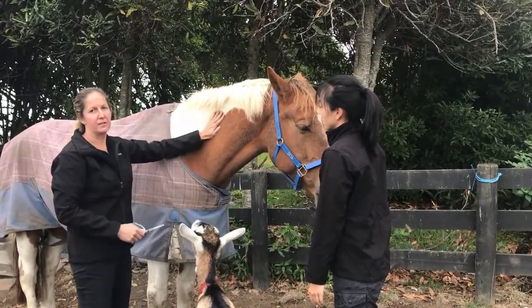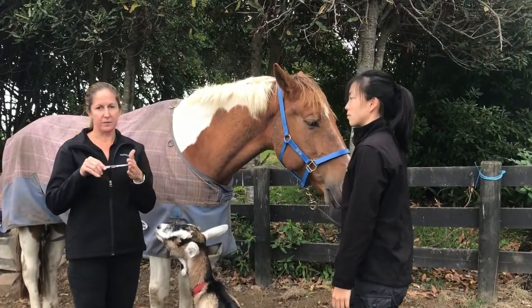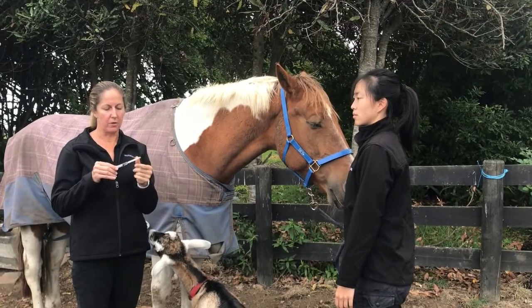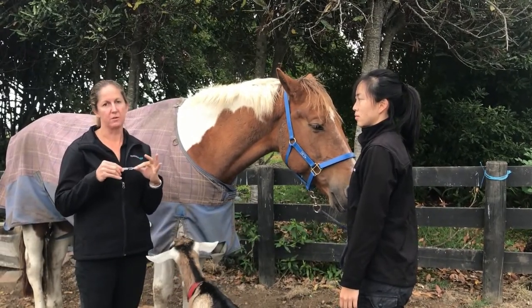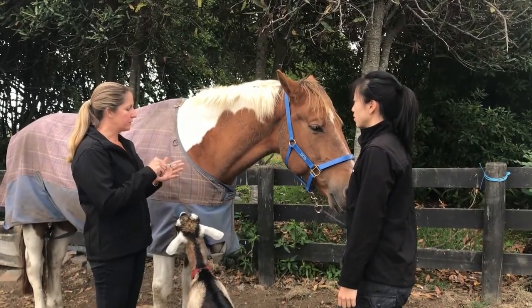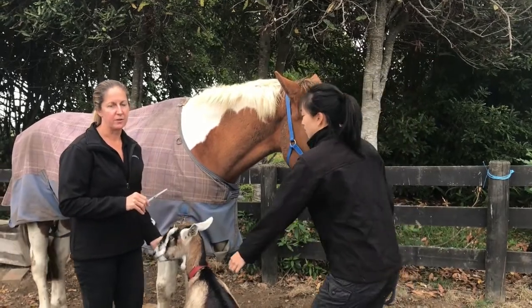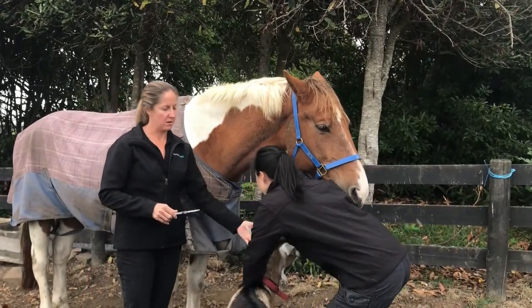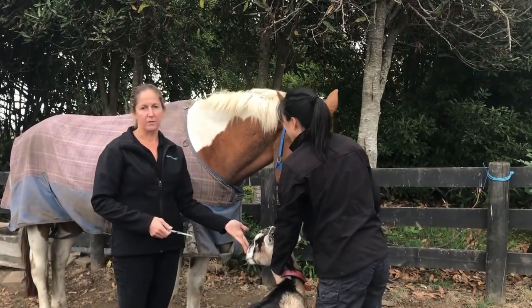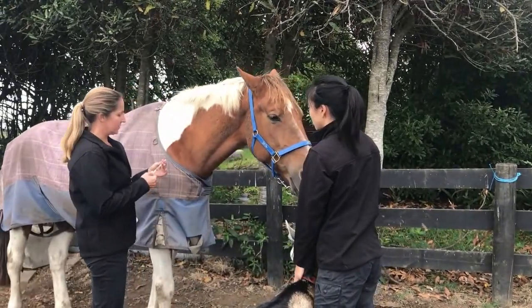That triangle is the safe zone. We recommend going straight in, perpendicular to the skin, all the way to the hub of the needle. That way, if they move toward you, you haven't gone any deeper. Once you're in all the way, draw back and check for blood. If you don't see any blood, go ahead and inject. Most of the time you'll be giving an antibiotic or a vaccine.